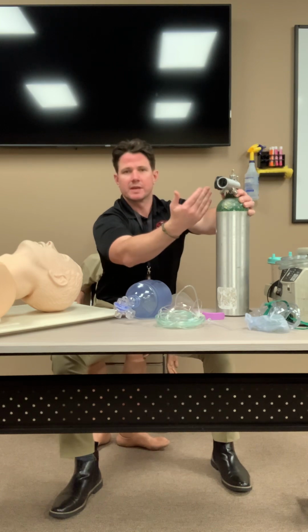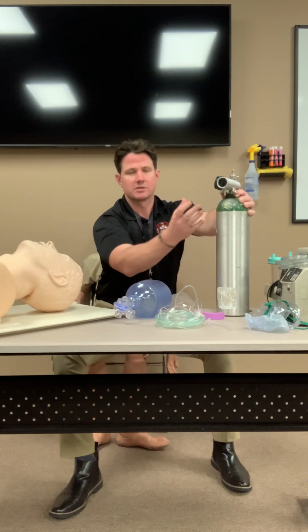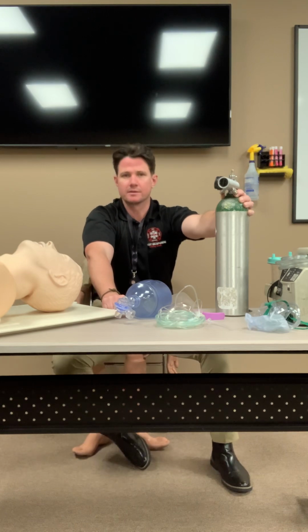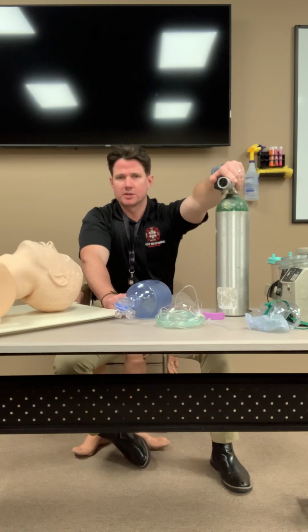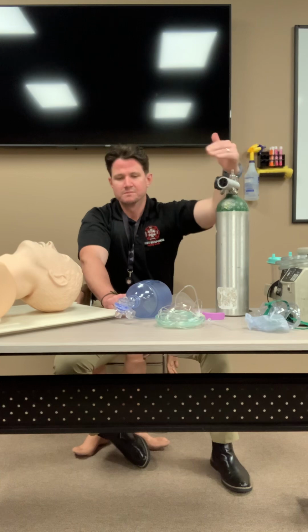I have 2,000 PSI on my full bottle. When I get down to 500 PSI, that's when I'm going to change it if it's not on a patient. If it's on a patient, I'm going to change out my bottle at 250 PSI. All of that should be verbalized, right? That way we know that you know what you're doing, okay? Once this is all set up, everything's good to go. There's no leaks. You've confirmed your pressures, all right?